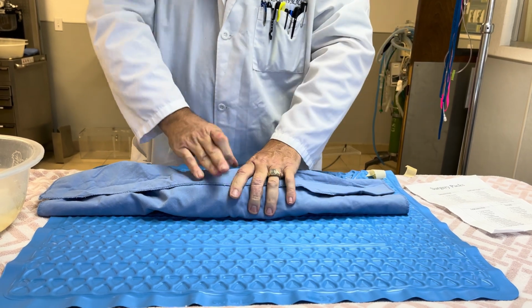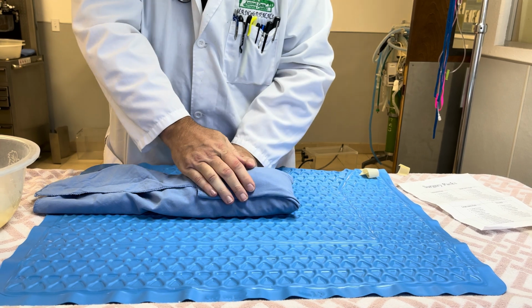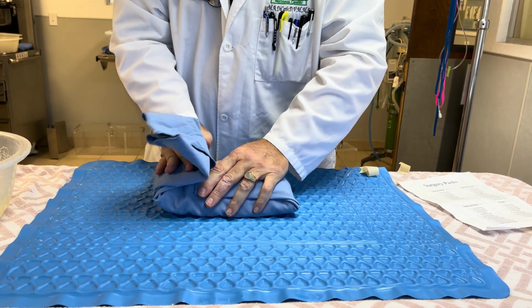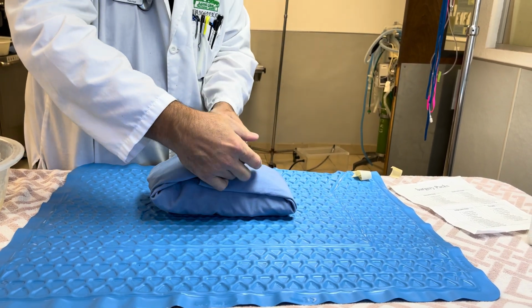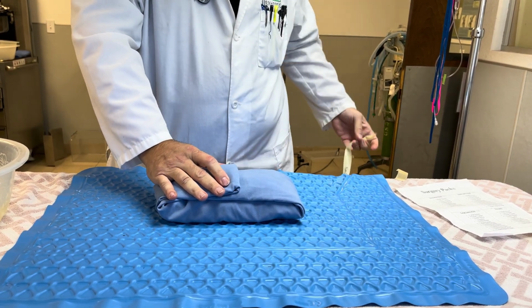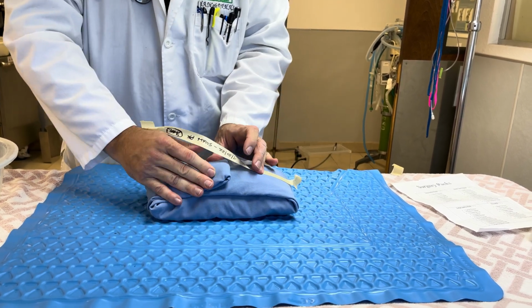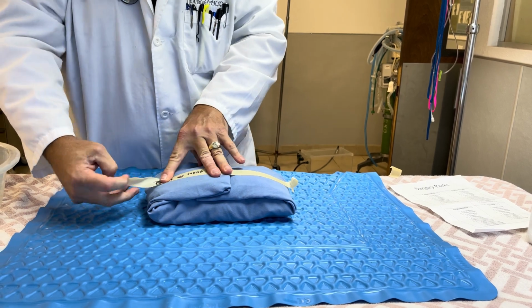This needs to be nice and tight. You'll be able to tell it's not falling around. And then you'll pull this up, okay? And you won't fold that, but then this top one, you'll pull up and fold under, okay? Then you take your regular masking tape and keep the pressure on it. Once you've taped it, you're going to be good.